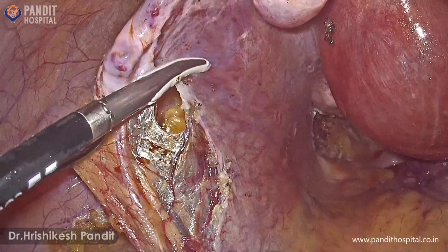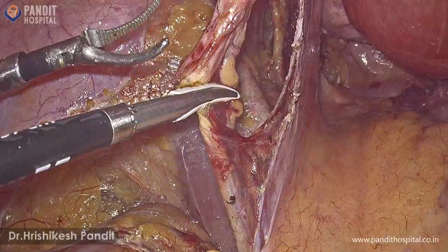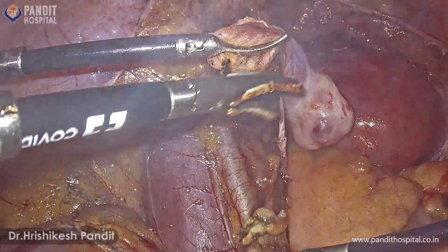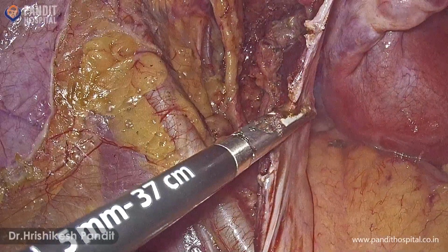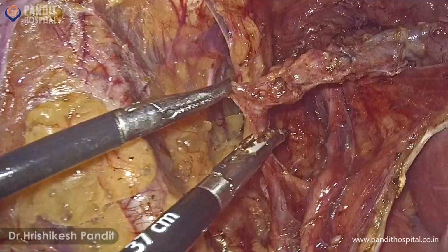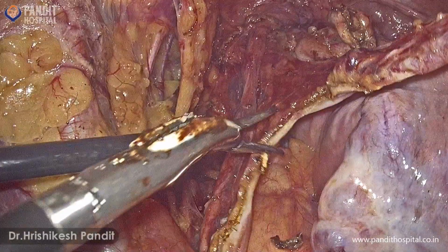Next we create a window in the broad ligament and coagulate and cut the IP ligament. Here we are using Covidien LigaSure for coagulation and cutting of the IP ligament and also to cut the broad ligament. Now we are coagulating and cutting the uterine artery at its origin.